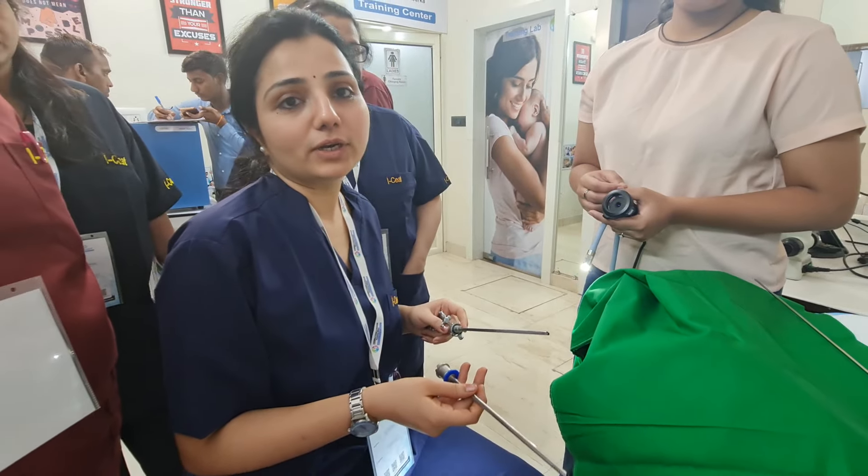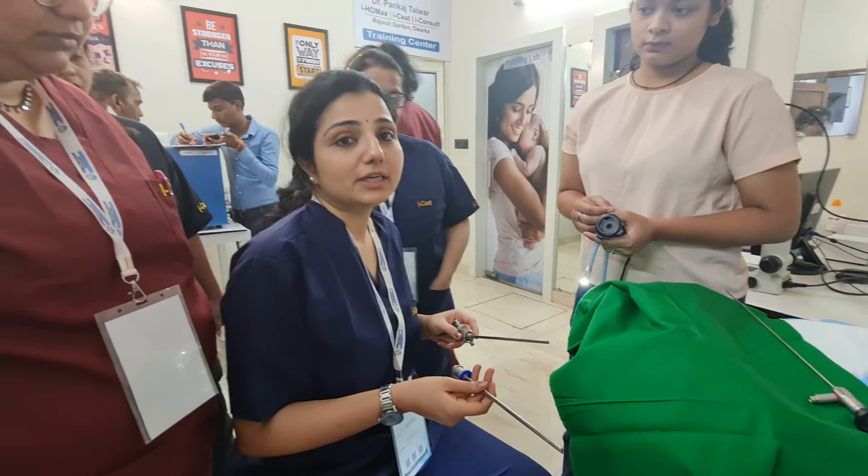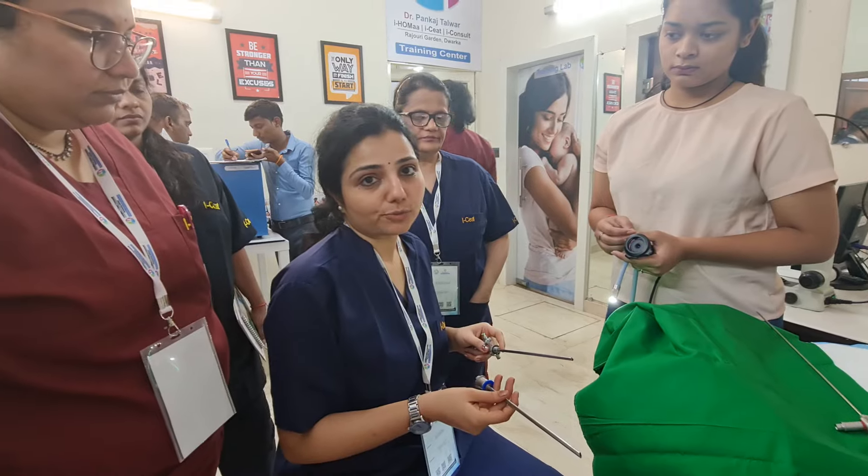Hello everyone, myself Dr. Gauri Raya from Indore. Today I will tell you about the diagnostic hysteroscope.